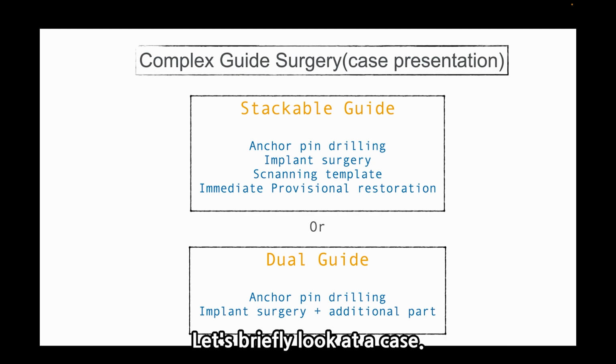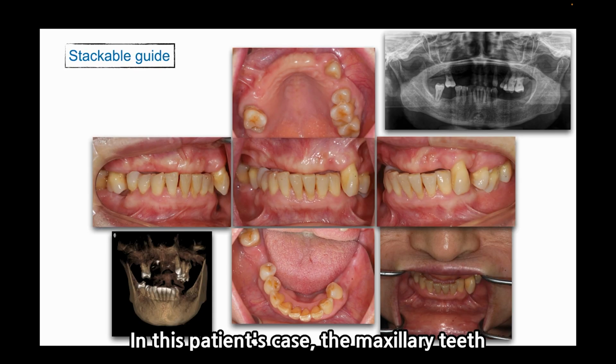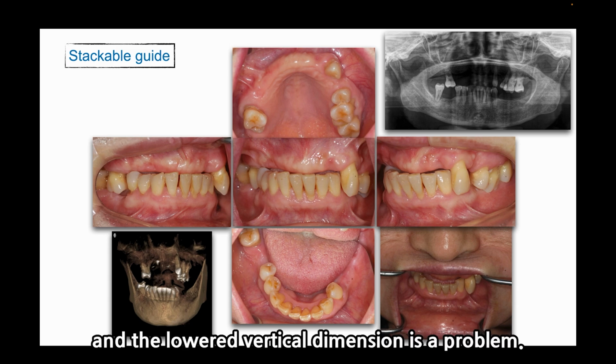Let's briefly look at the case. In this patient case, the maxillary teeth are all scheduled for extraction and the lower vertical dimension is a problem.